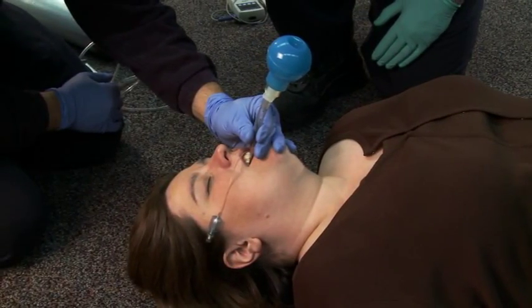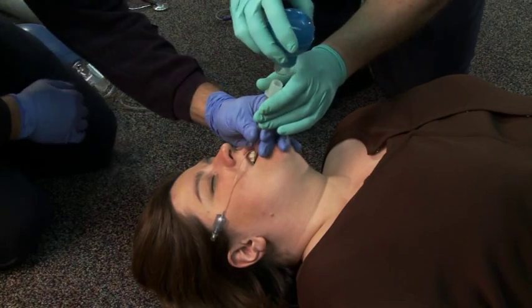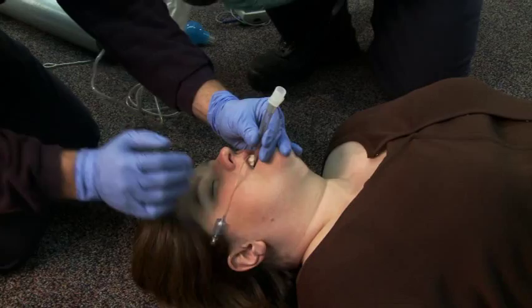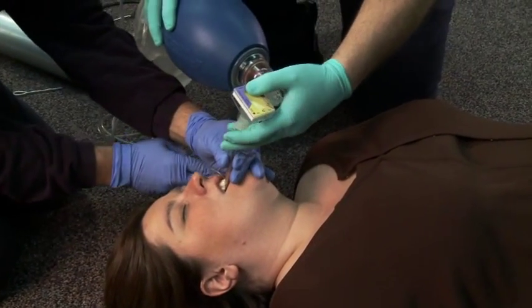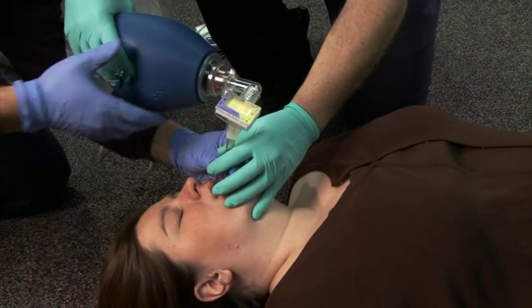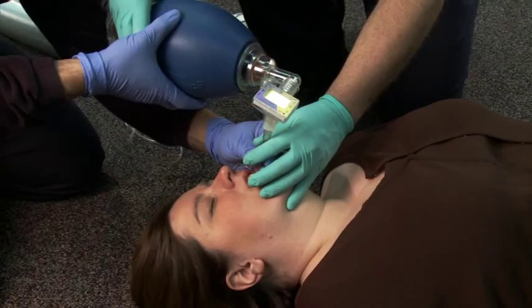While each of the techniques in both the clinical assessments and adjunctive devices has unique qualities, none of the assessments or devices is 100% accurate by itself. Therefore, two or more of the clinical assessment techniques should be performed, followed by the use of at least one of the adjunctive devices.